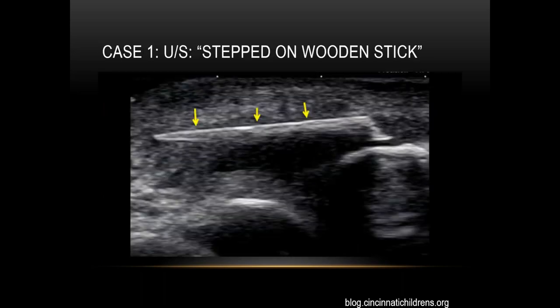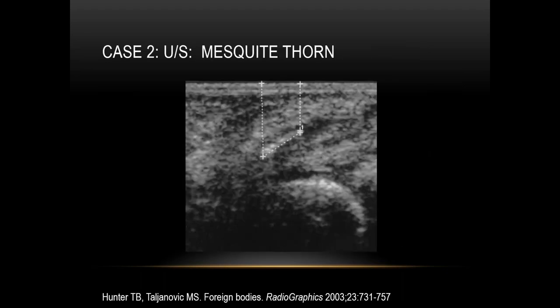Here is an example: a patient stepped on a wooden stick. You can see the hyperechoic linear foreign body with relatively clean posterior acoustic shadowing. In another case, a patient had a mesquite thorn in the subcutaneous tissues. You can see the hyperechoic thorn and some dirty posterior acoustic shadowing.